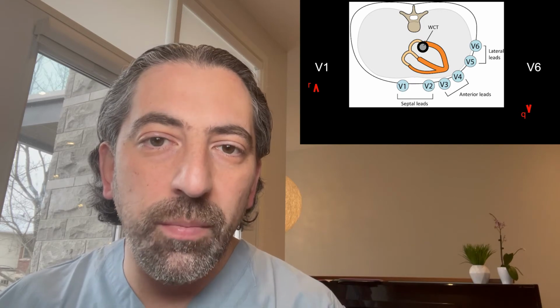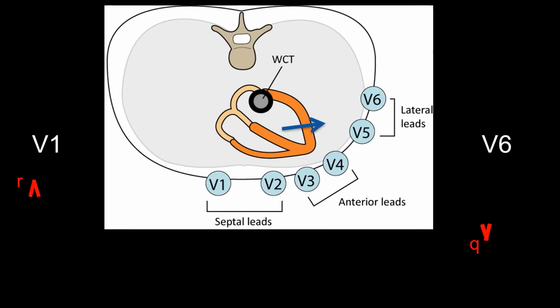Following that, because the left ventricle comprises most of the myocardium, in other words, it's thicker than the right ventricle, the major vector of depolarization will be determined by the left ventricle. And the overall vector of depolarization will be going from right to left, which is going to be negative in lead V1, giving a deep S wave, and positive in lead V6, giving a large R wave.